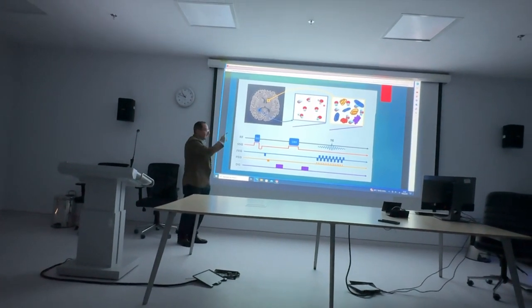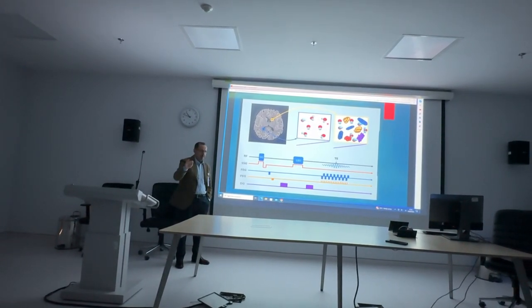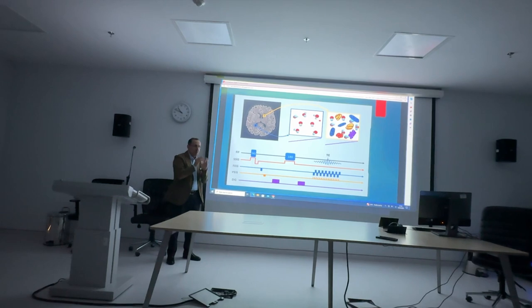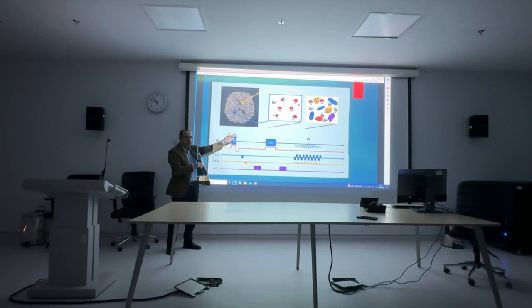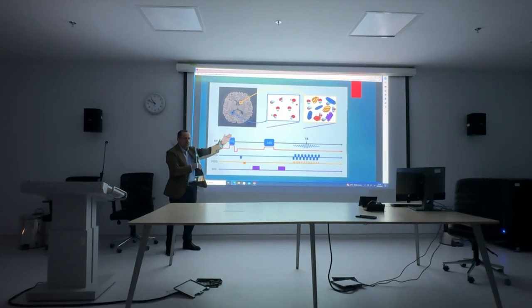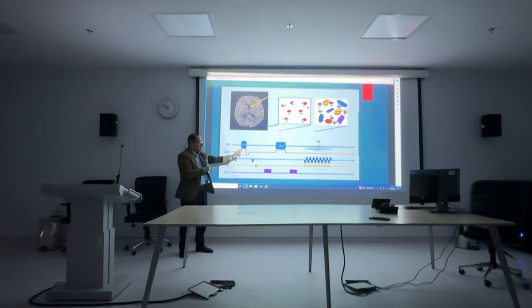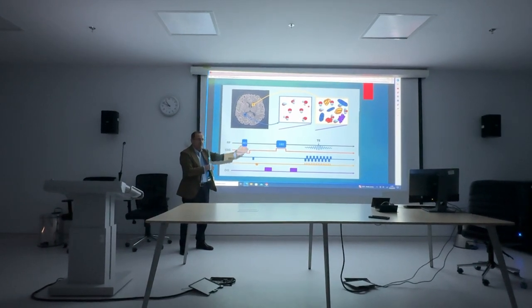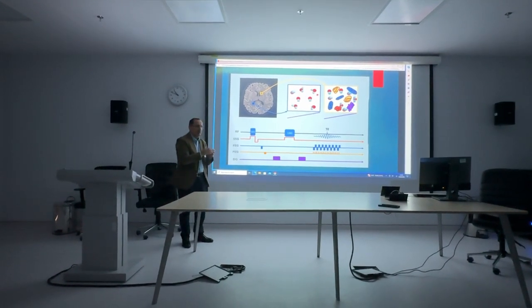What will happen there? The movement of particles is almost neglected in this subject. Okay? Remember and memorize this point: no effect of the first gradient or second gradient will happen on the stationary phase of the inflamed or affected or pathological tissue. So what we are left with in the second tissue is a rephasing, keeping in phase due to the 180 pulse, and we are having a high signal.